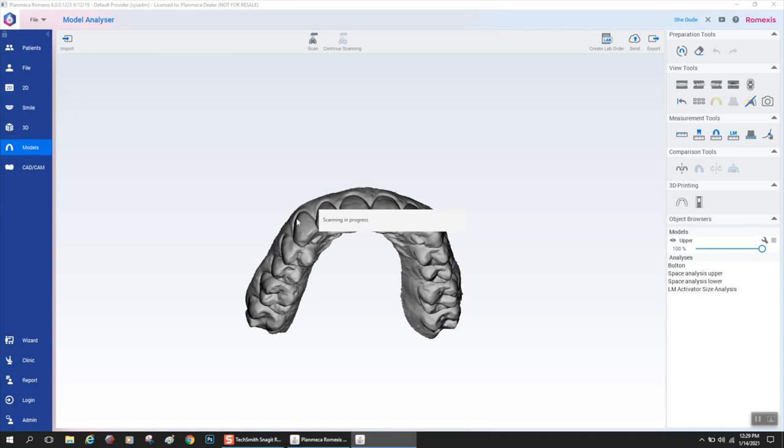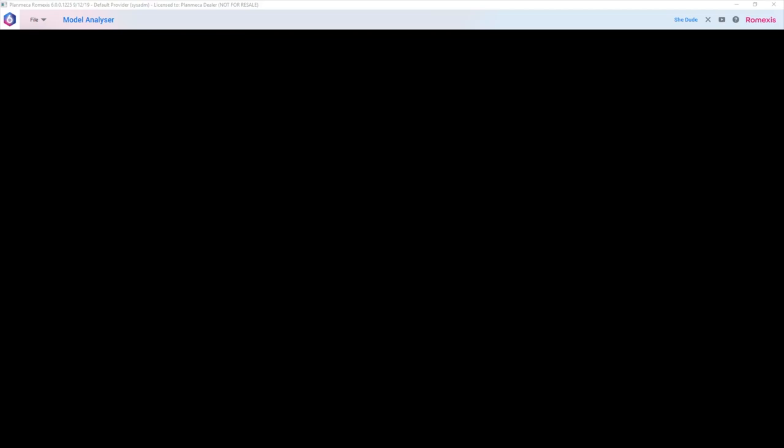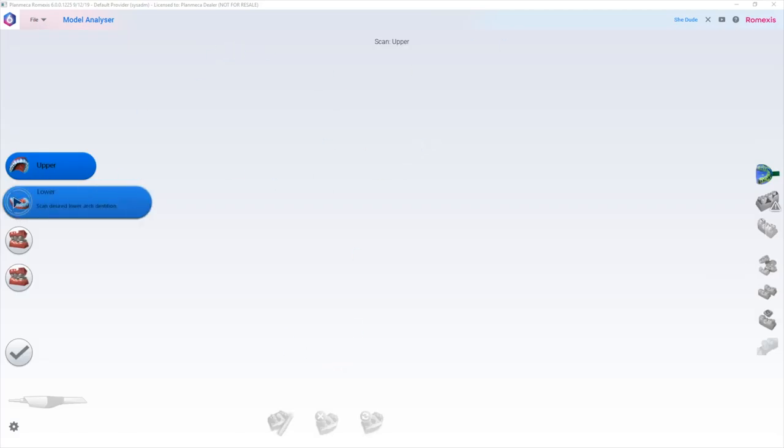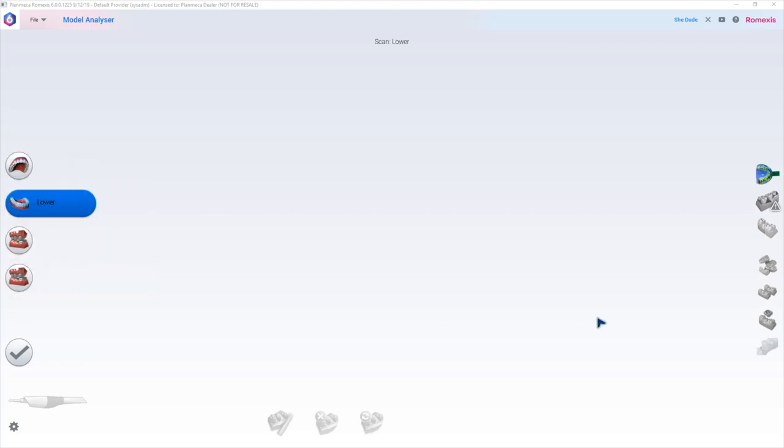The other thing you could do is scan natively in the model analyzer software. This is particularly important for orthodontists who don't do anything with crown and bridge and don't want to click a tooth and select the shade and material. They just want to go right into scanning. By clicking scan in model analyzer, it will open up the scan tab instantly and you could go right to scanning.